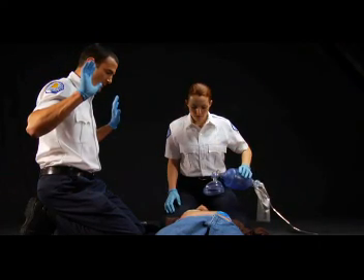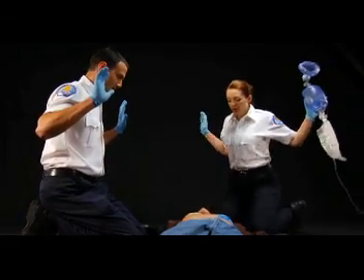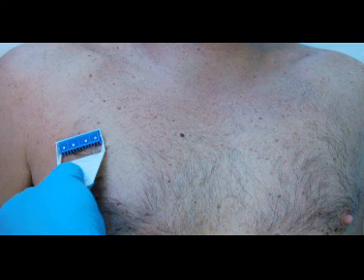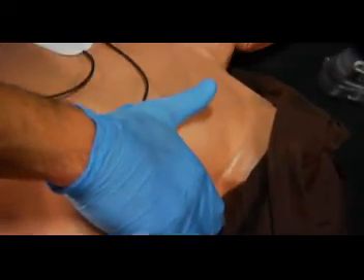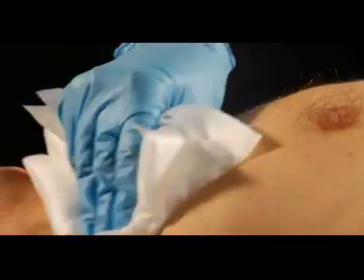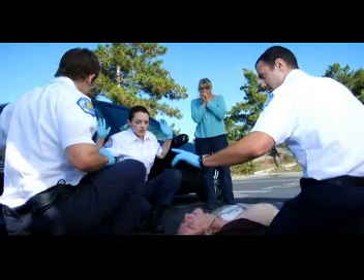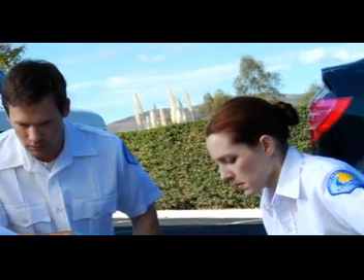Let's do a quick review. Do not move or touch the victim while the AED is analyzing. Clear the victim and turn off the oxygen — or move the oxygen mask at least three feet away — before shocking. Dry any water from the chest and move the victim if they are lying in a pool or puddle of water. Shave a hairy chest before applying the pads. Adjust pad placement as needed for any implanted devices. Remove medication patches that interfere with pad placement and wipe the skin clean before attaching the pads. I'm clear. You're clear. We're all clear. Oxygen clear. Shocking. Shock delivered. Begin CPR.